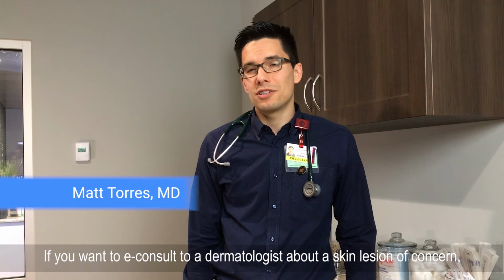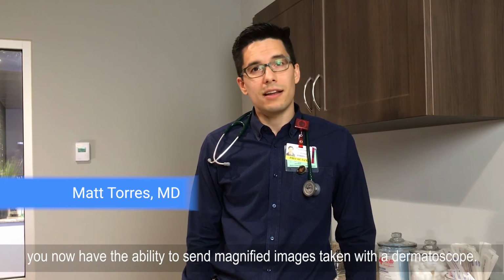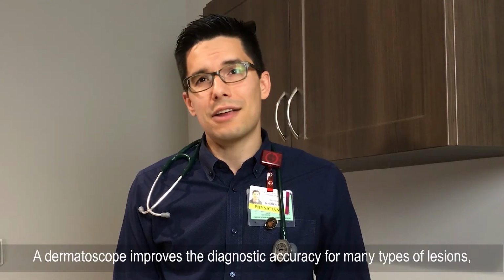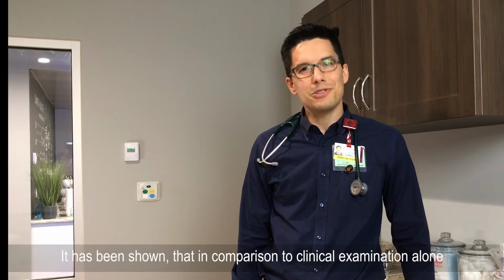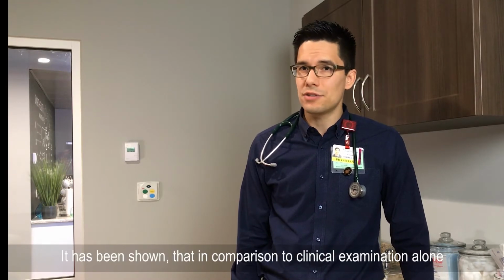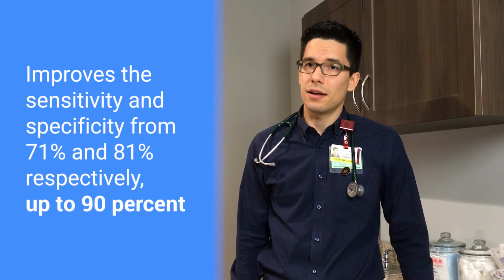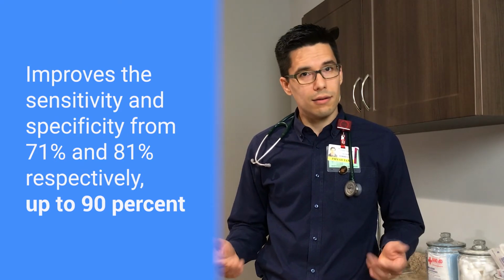If you want to e-consult a dermatologist about a skin lesion of concern, you now have the ability to send magnified images taken with a dermatoscope. A dermatoscope improves the diagnostic accuracy for many types of lesions, particularly for melanoma. It has been shown that in comparison to clinical examination alone, the use of a dermatoscope improves the sensitivity and specificity from 71 and 81% respectively up to 90%.